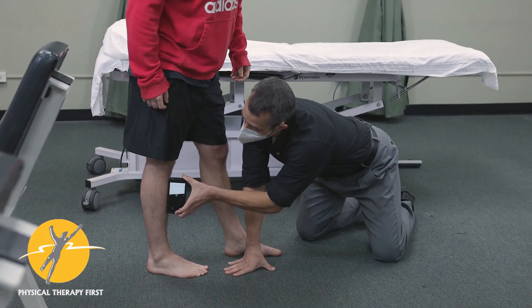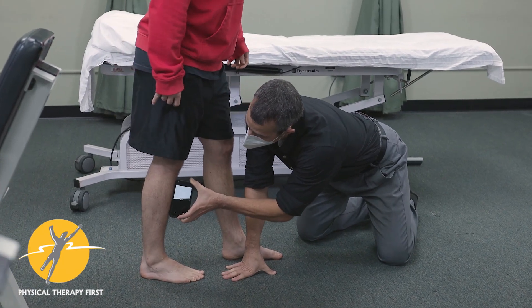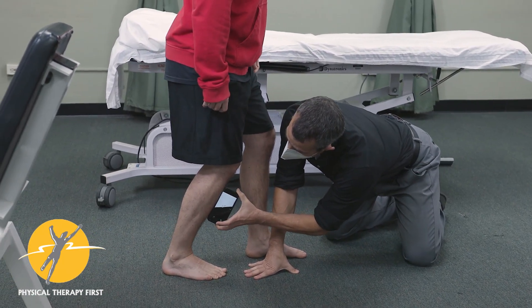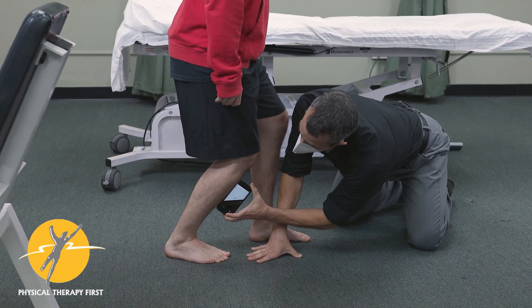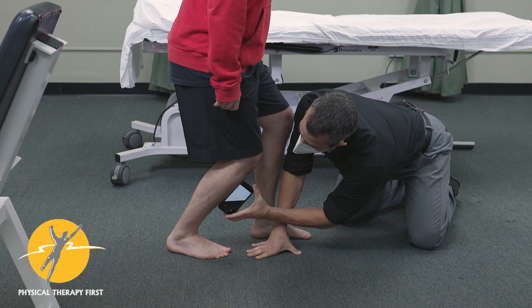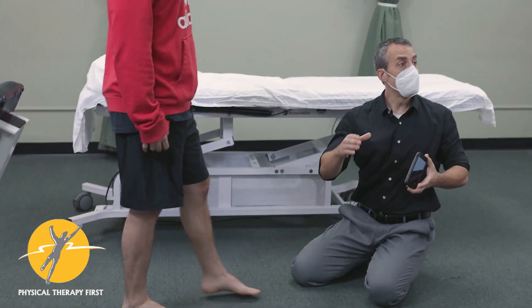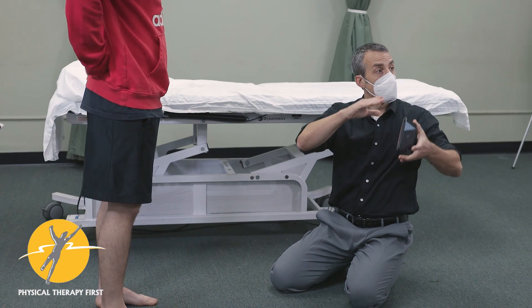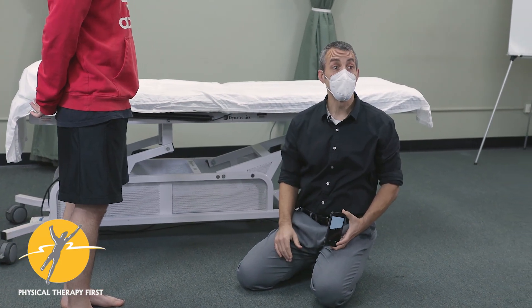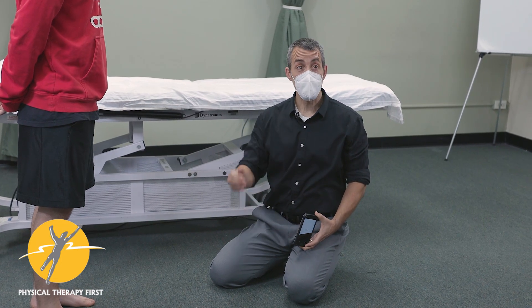You could also have them start from standing and then bend the knee, dorsiflexing all the way down — you can do it in this position too and get about the same measurement. You just have to make sure everything is zeroed out first before you start.